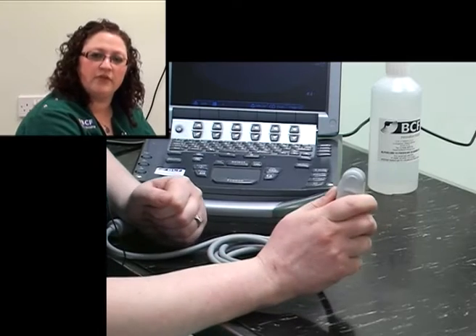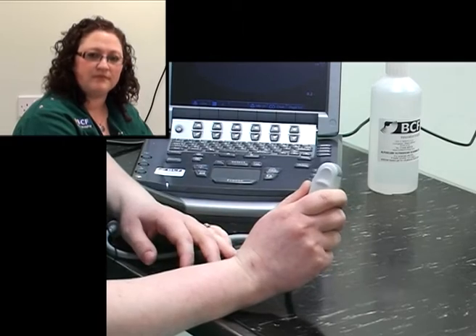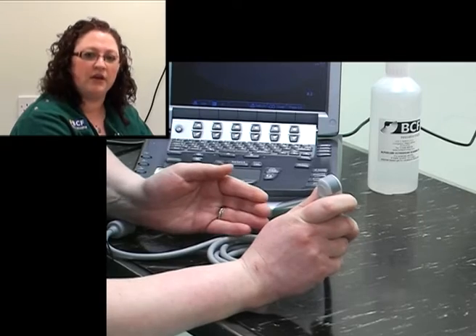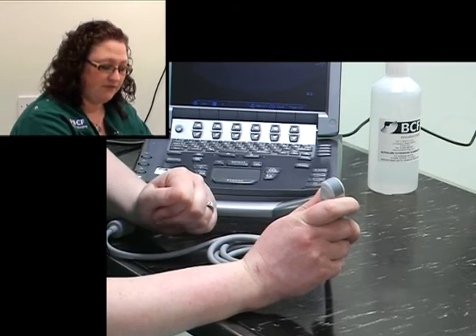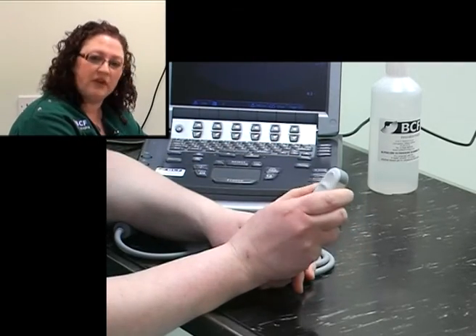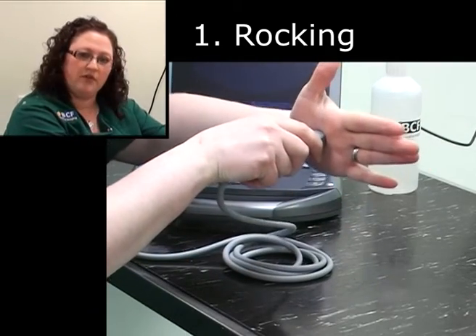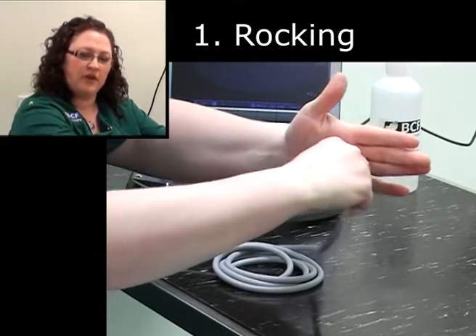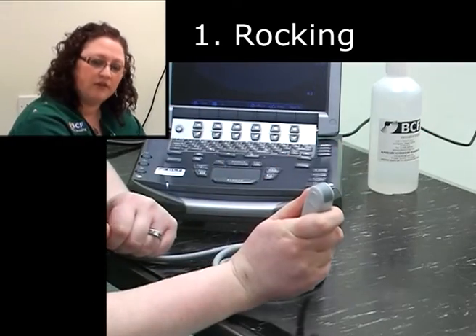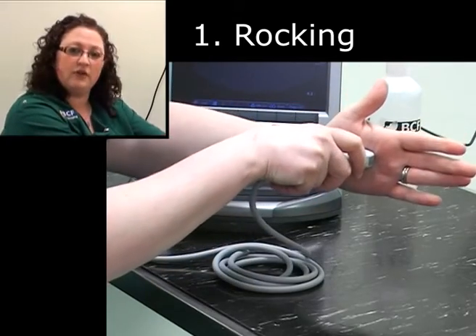Now we'll go on to some of the movements that you can perform while doing an ultrasound examination. This will help to examine every organ in a thorough and methodical manner to ensure you're seeing everything that you should. There are five movements. The first is rocking, which is placing the probe on the patient and moving it side to side along the surface of the crystals or the footprint itself.